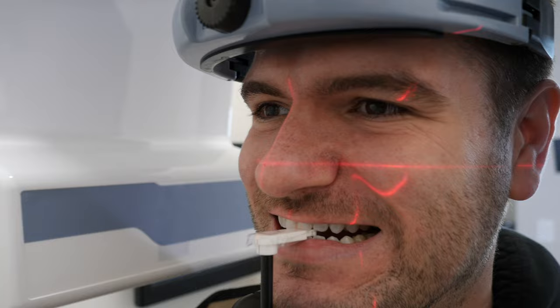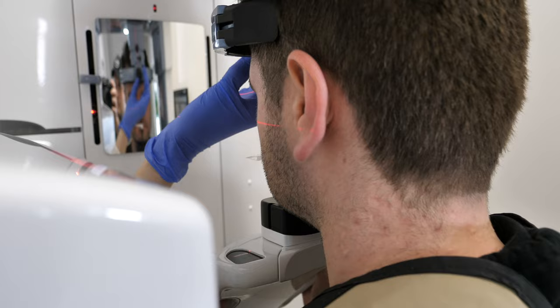Before they press the button to take the image, they will let you know if they want your tongue on the roof of your mouth or not, and sometimes they will even ask you to swallow beforehand as well.